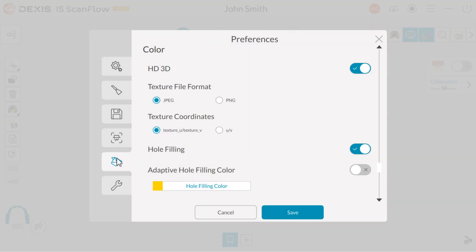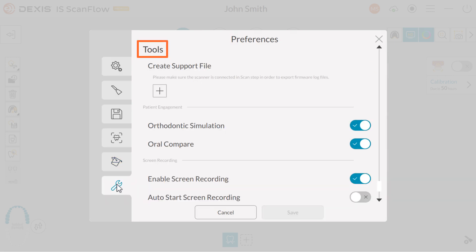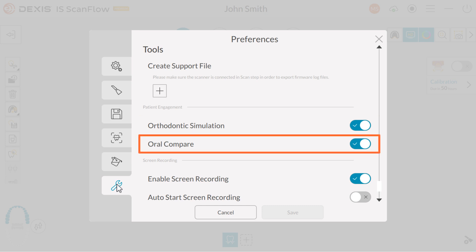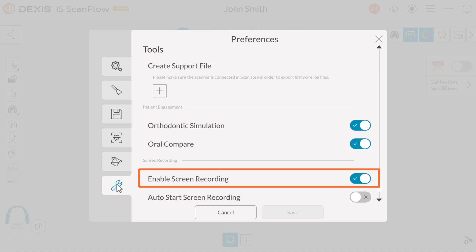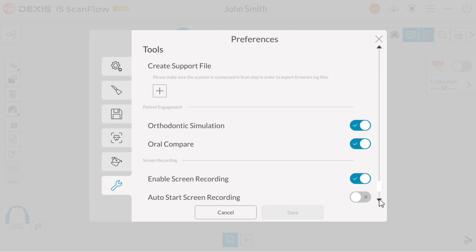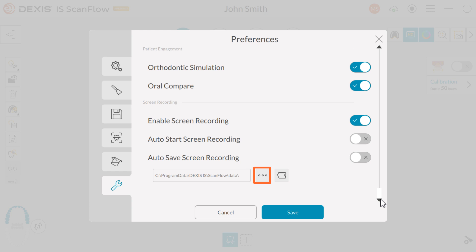Next, click the Tools tab. Under Tools, you have the following options. Orthodontic simulation: enable this option if you want the ability to demonstrate before and after orthodontic treatment. Enable oral compare if you want the ability to overlay scans from different capture dates and check or measure the differences. Enable screen recording is routinely enabled — this feature records up to two hours of acquisition data as an MP4 file, useful as a training aid and troubleshooting tool. Enable autosave screen recording if you want to automatically save a copy of the MP4 file. Click the ellipsis icon to select where you want to save the MP4 files, and click the folder icon to open the folder containing the MP4 files. Then click Save to save your preferences.